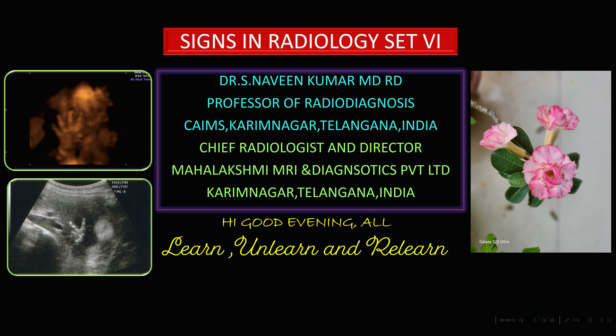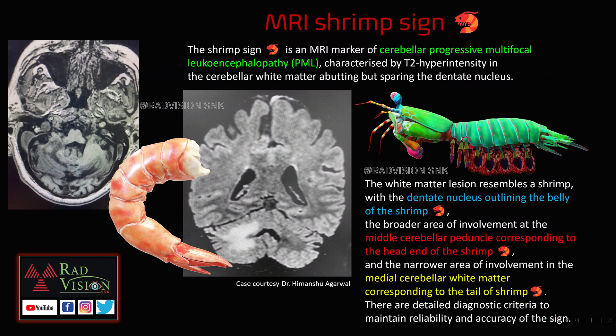Good evening all, welcome to this new session. We will try to see signs in radiology, set 6. Coming to the first case, here you can see there is a white matter hyperintense lesion typically located in the cerebellum, which mimics the shrimp. So what is this shrimp or MRI shrimp sign?